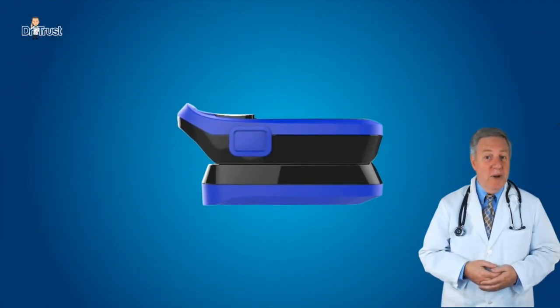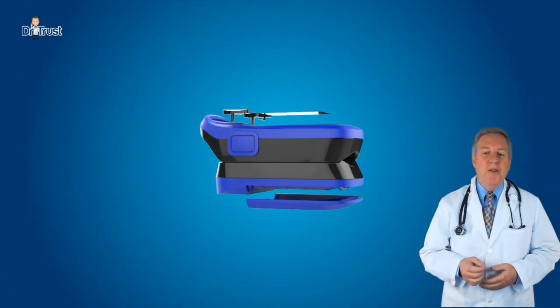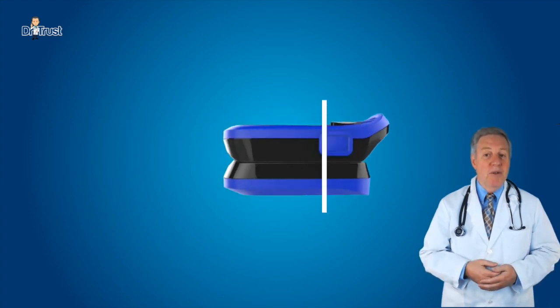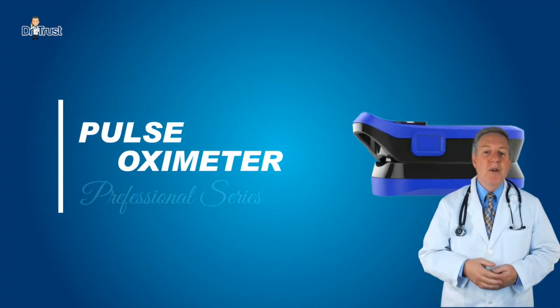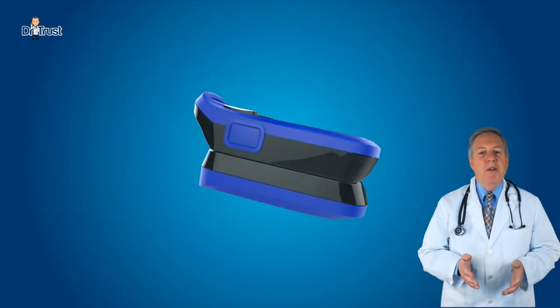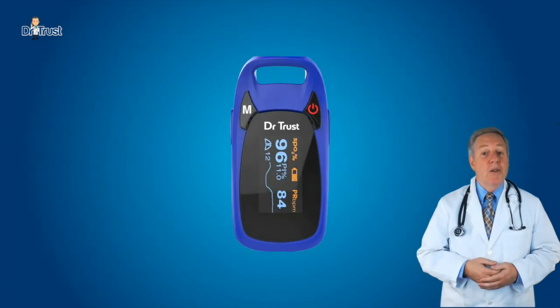The Dr. Trust USA Professional Series Fingertip Pulse Oximeter is based on all digital technology and is intended for non-invasive spot check measurement of functional oxygen saturation of arterial hemoglobin. The Professional Series Fingertip Pulse Oximeter is water resistant.